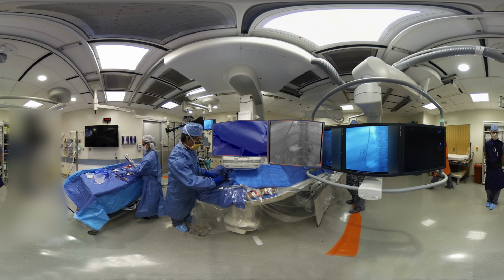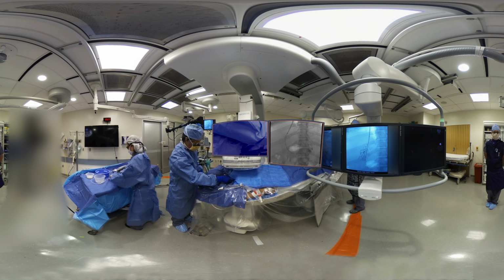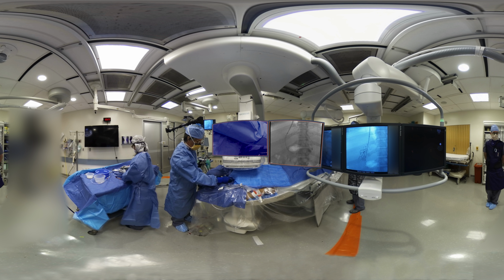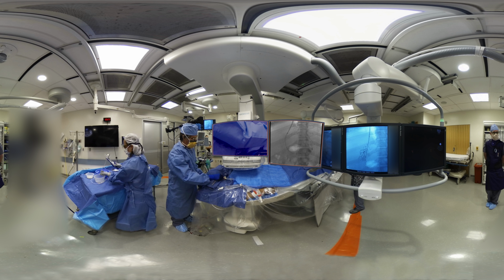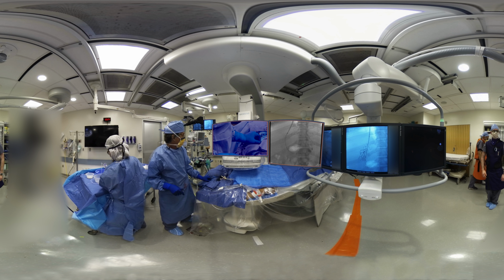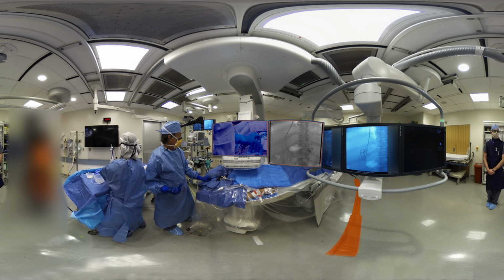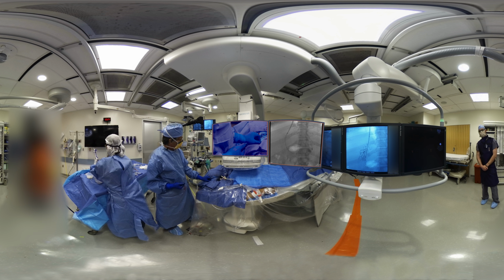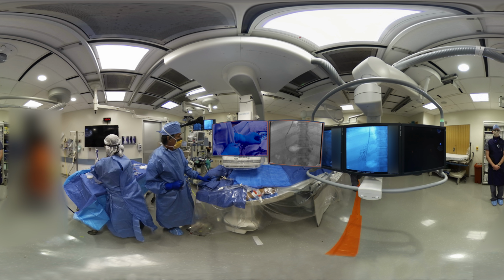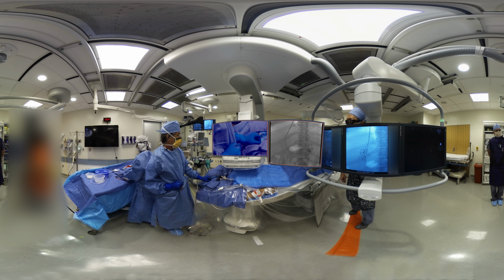So I'm going to connect up to our pressure transducer. I'm guessing a portal pressure of 31. Let's see what we get. I see a 36. Come on, come down a little bit. I'm not going to have my number today. So our initial portal pressure is 37.